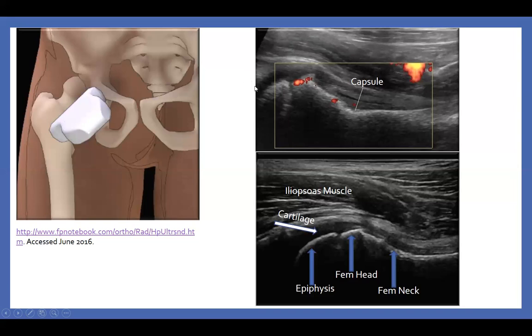So that's where you're going to see them more up here. In this picture, you do not see them. But again, pay attention to this anatomy, and I think you'll be in great shape as you move forward. So let's take a look. By the way, also something I mentioned earlier. When you look at the capsule, this is the capsule.